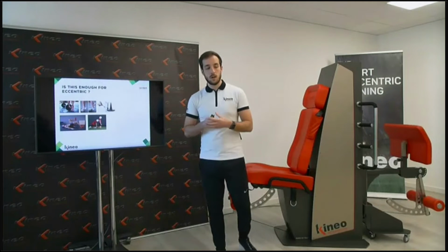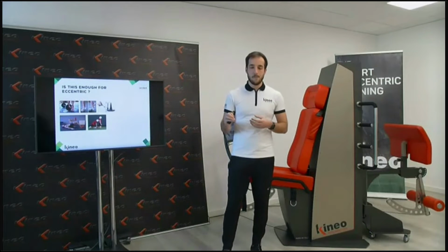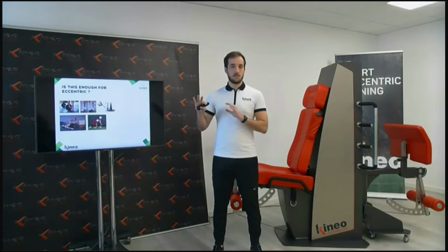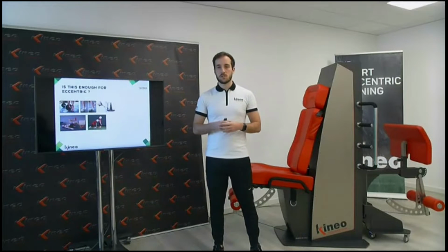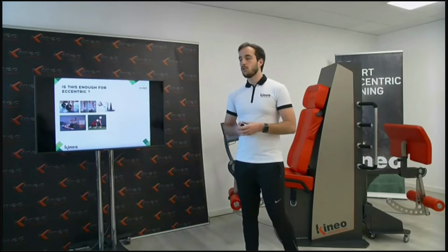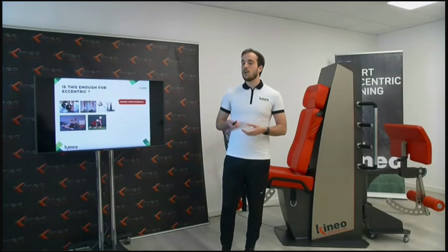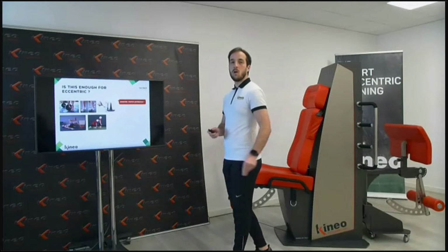Is this enough for making sure that eccentric capability is stimulated in the right way, in the proper way, based on the fact that we know from science that eccentric strength is very much higher than the concentric one? So the question that I would like to ask you guys who are listening to this presentation is: are those training methodologies giving eccentric proper overload?